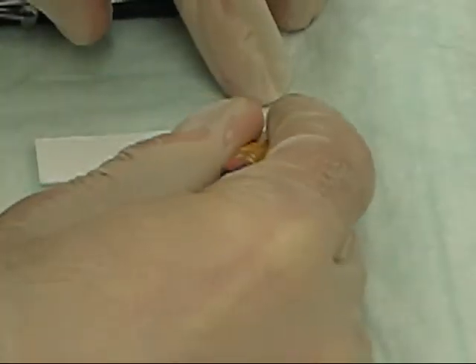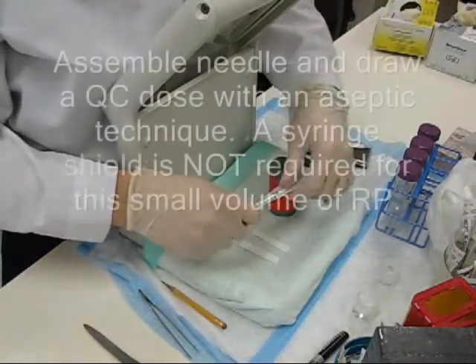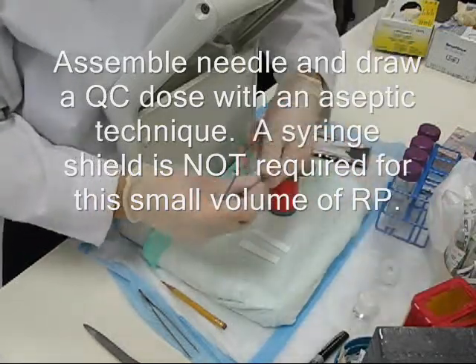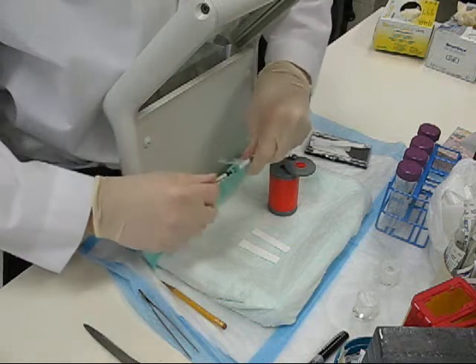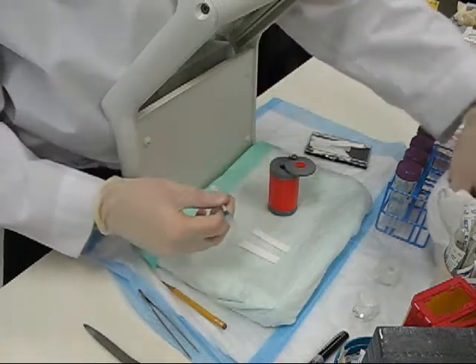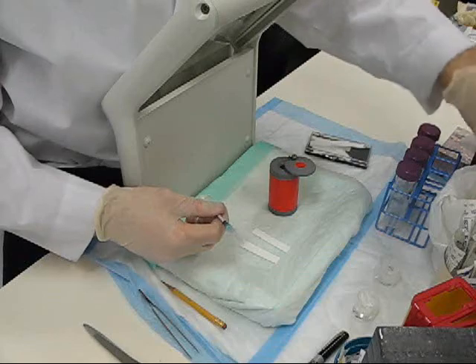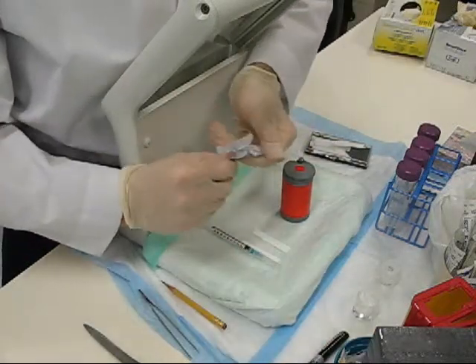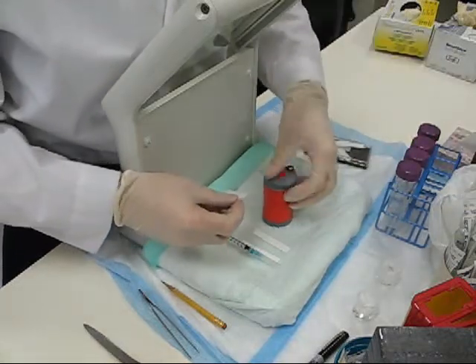If you are worried about confusing which strip is MEK or which is NACL, you can label each strip with an M and an N respectively. This is a good way to keep them organized.